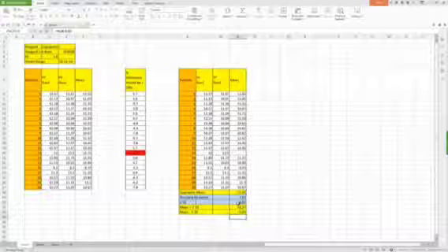Geometric mean plus 2SD and geometric mean minus 2SD will give you the upper and the lower limits, or the range between which the values should lie. Hence, the upper limit is 14.27 seconds and the lower limit is 8.23 seconds. Now, look through all the mean values to see if any exceed the specified limits. Exclude all these outliers. That is, any value that does not lie within this range.